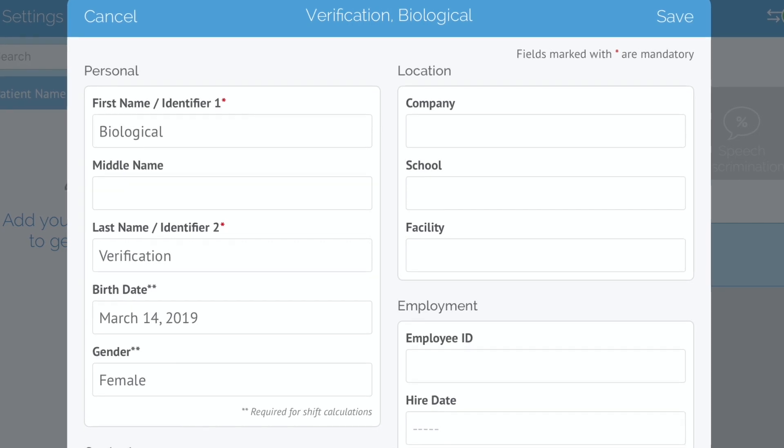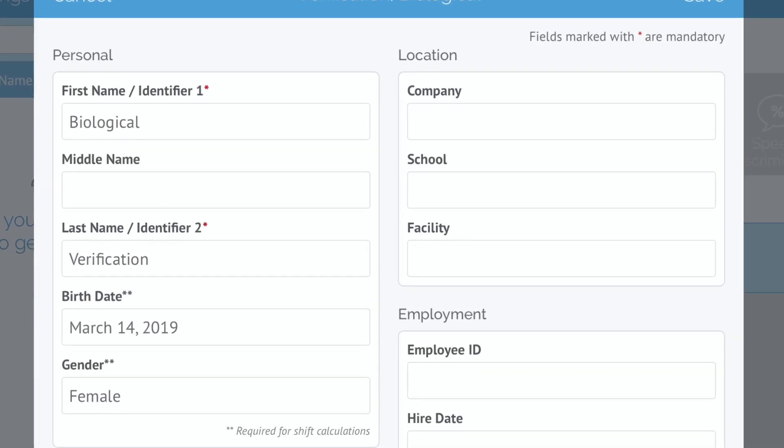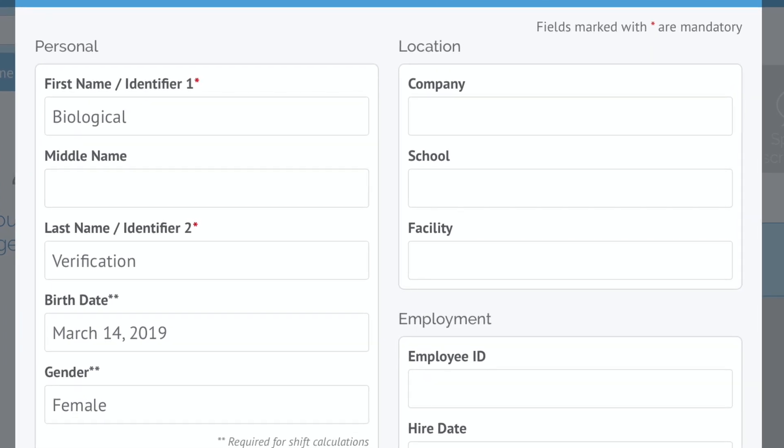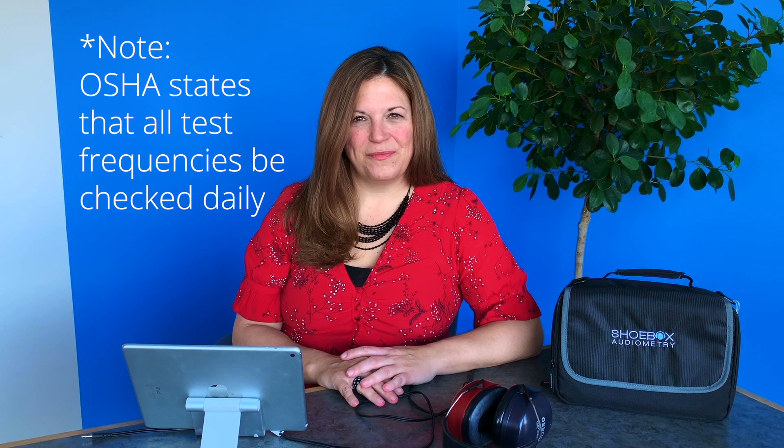In order to do this, you would want to set up a patient in your system entitled biological verification, or another title that makes it easy to find, and test a minimum of three frequencies per ear. You'll want to do the baseline test on yourself or a member of your team when their ears are free and clear and there's no congestion.